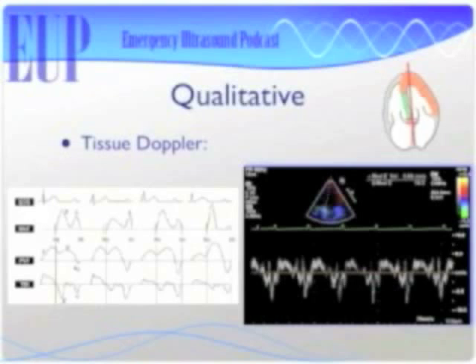You can see all the way on the left is normal, E prime greater than A prime. And that E prime should be greater than 8. That's considered normal, and E prime greater than 8. Do I really need to know that? Yes. Because if it's greater than 8, then you're done. But can I just look at the A? I'd go with the number 2.